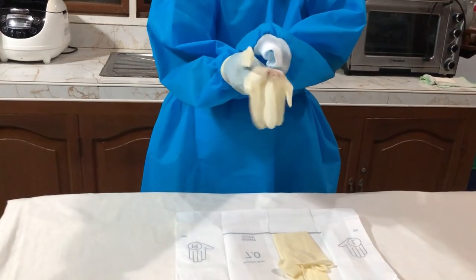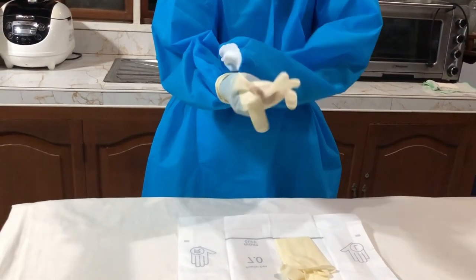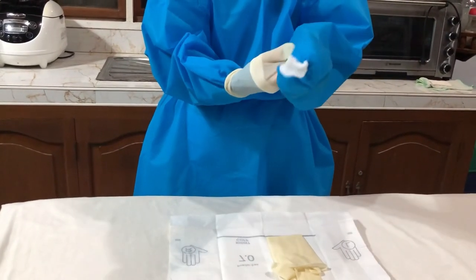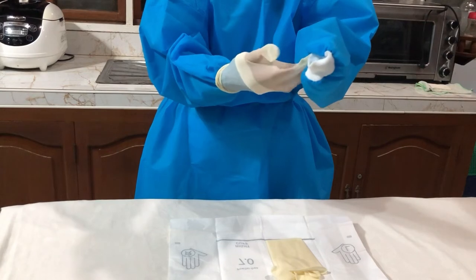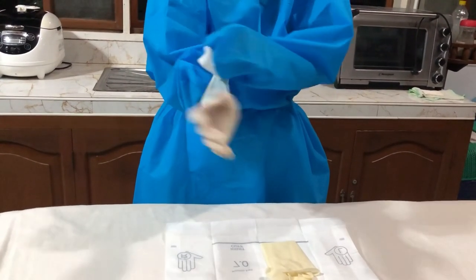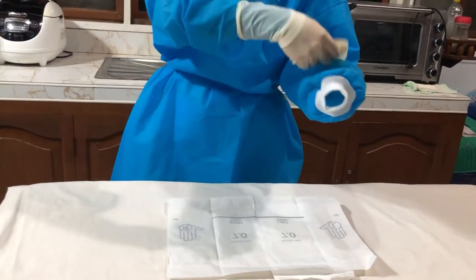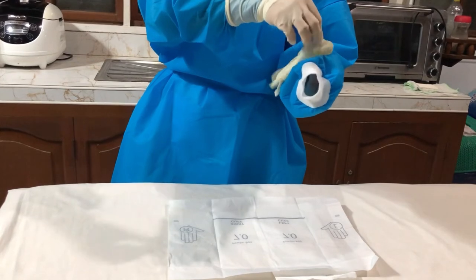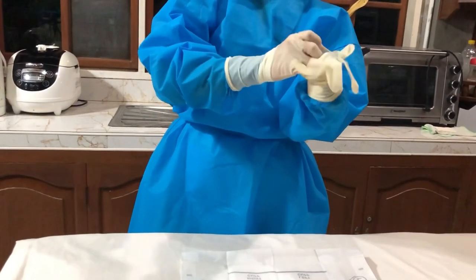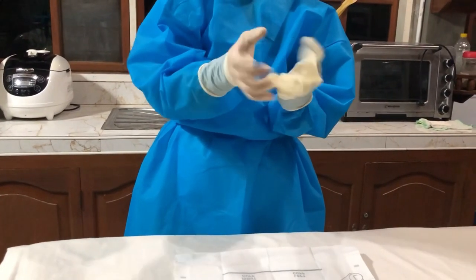Step 11: with the sleeve dominant hand, grasp the cuff of the glove and the gown sleeve of the non-dominant hand. Slowly extend the fingers into the gloves, making sure that the cuff of the glove remains above the cuff of the gown sleeve, to provide a closed sterile method of gloving. Step 12: with the gloved non-dominant hand, put the glove on the dominant hand by repeating steps 9 and 10, to maintain aseptic technique in donning gloves on the dominant hand. After all of that, adjust fit and remove wrinkles of the gloves.